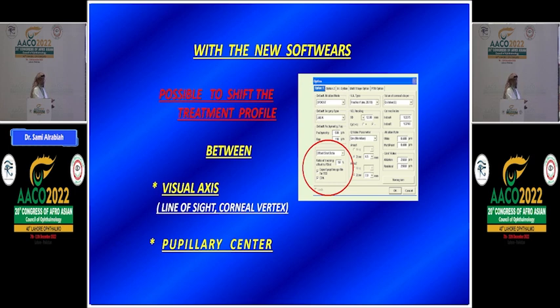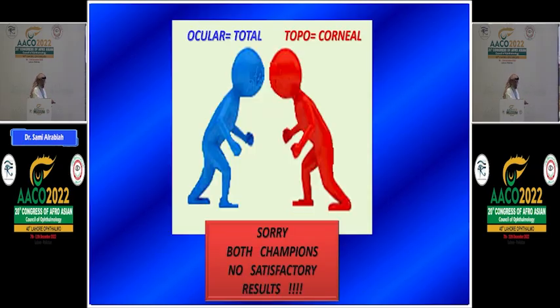Why is that? Because most of our machines now, you can decenter your treatment. So you can shift your treatment from where it is, I mean in the wavefront, not in topography, because topography is already on the visual axis. But if it's wavefront, you can ask it, please shift it to the visual axis. And here it is where you can shift it. So the benefit of topography guided, being on the visual axis, is no more a benefit, because you can get the same with the wavefront. Most of the machines, you have to look at your machine before you go for wavefront guided. Shift it to the center of treatment or pupillary axis.